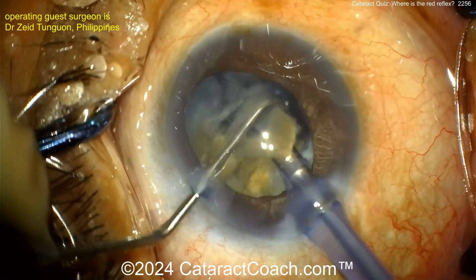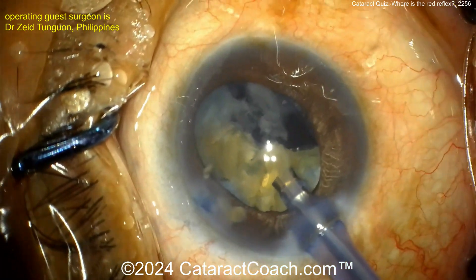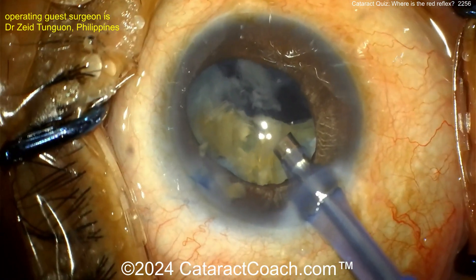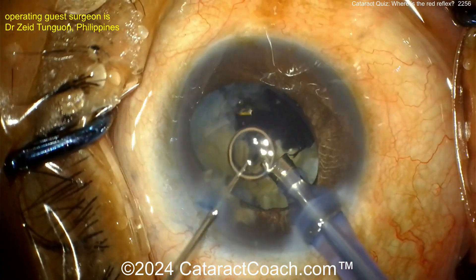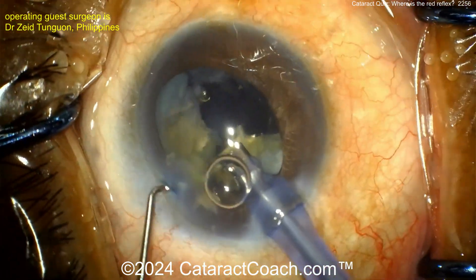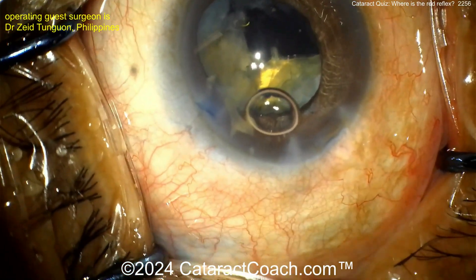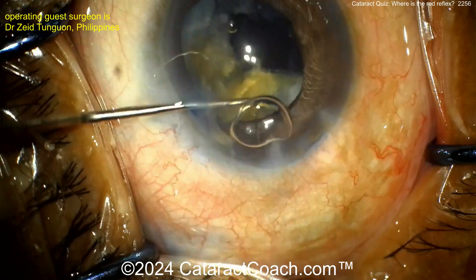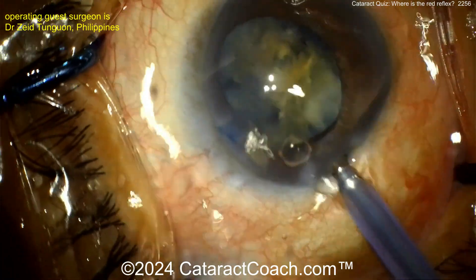Take your time because you really don't know what to expect here. Taking the pieces out nice and easy, and now there's that blue reflex — the dark blue reflex from the trypan. I like the idea of more viscoelastic to push the capsule back and give yourself a bigger buffer. That's a smart move. The surgeon can now evaluate a little bit better what's actually going on.